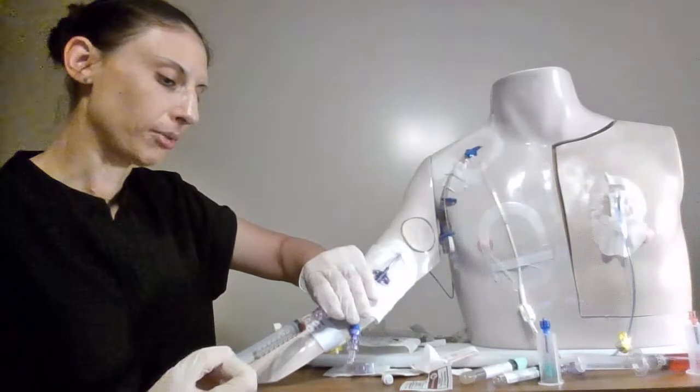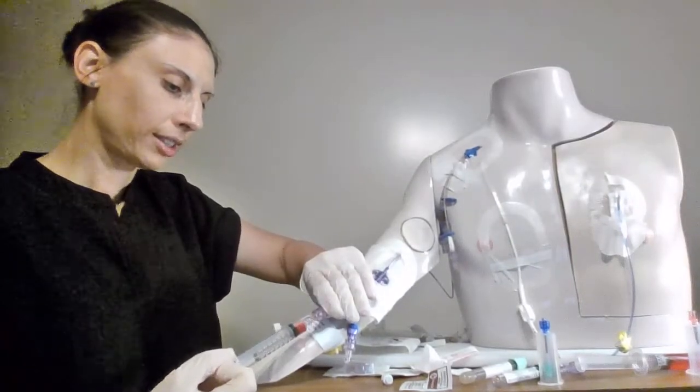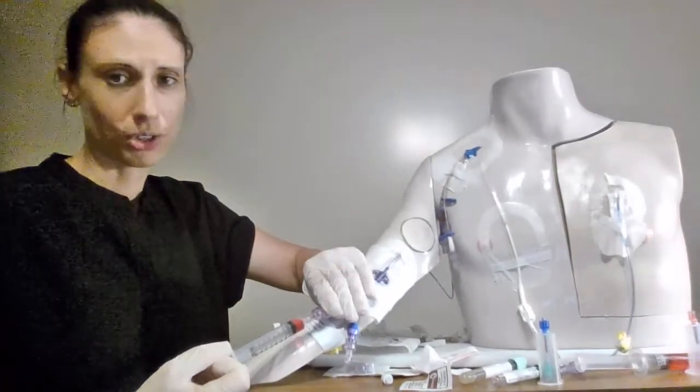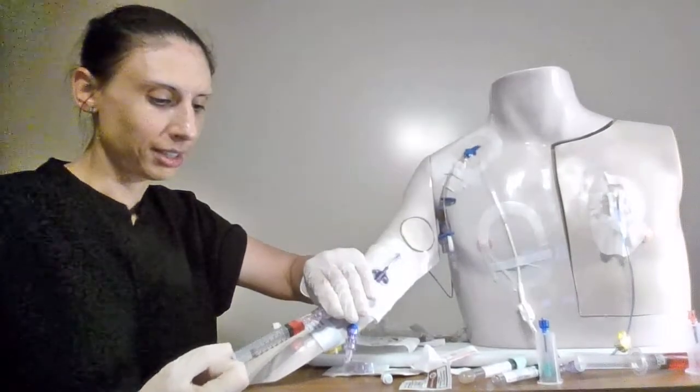Let's see if we'll get any blood return. And yes we do get some blood return. And PICs can be a little bit tricky. It takes a little while to get the blood flowing.